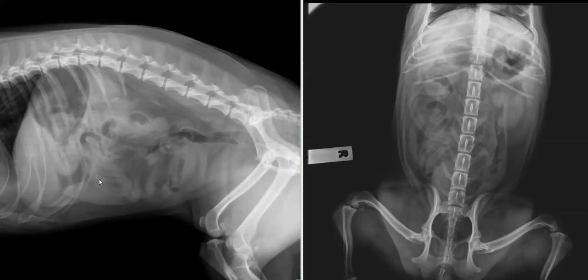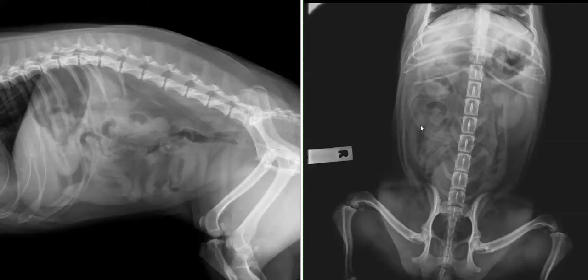After interpreting the colon, I go to the small intestine, and I leave this to last because it's definitely one of the hardest parts of the abdomen. You cannot interpret small intestinal wall thickness on a radiograph — it looks like the wall might be thickened here because we can see gas in the lumen, but it could be completely an artifact due to fluid in that lumen as well. So all we can say is that there is gas in the lumen, and you'd need an ultrasound to assess wall thickness. Small intestine is a bit like the hippie of the abdomen — it tends to lie free flowing and there shouldn't be any nasty sharp bends or curves; it's all gentle flowing, and mostly it contains soft tissue opacity and gas.